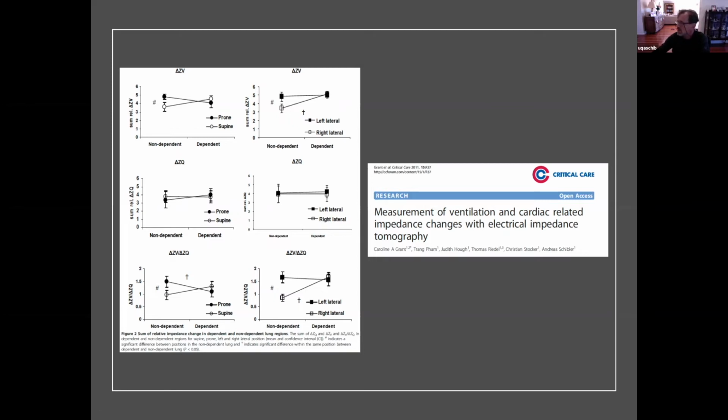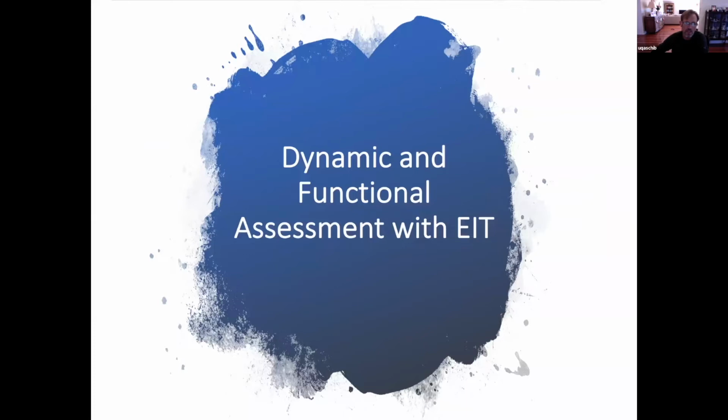So we have actually tools available currently that would tell us if we have equal ventilation perfusion or if we have a mismatch between ventilation and perfusion. These techniques are quite easy to implement, but haven't made it out of the research space into the commercial application of EIT.